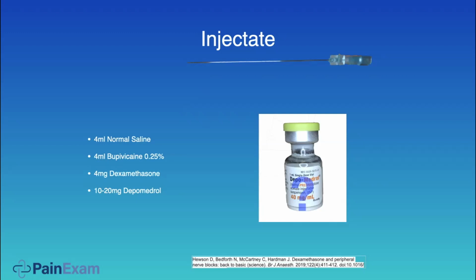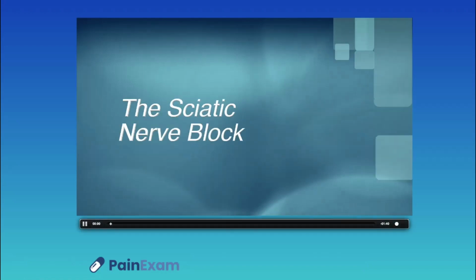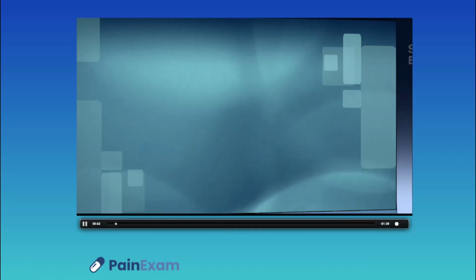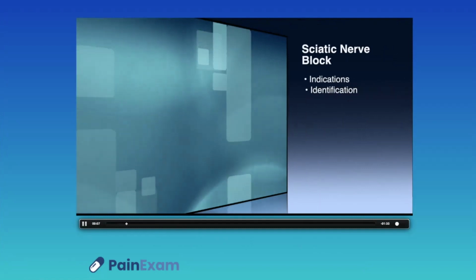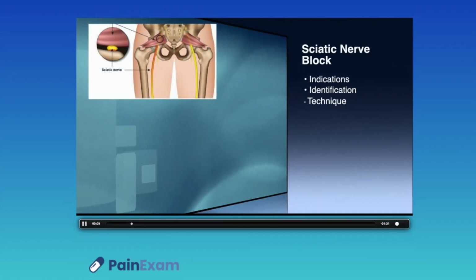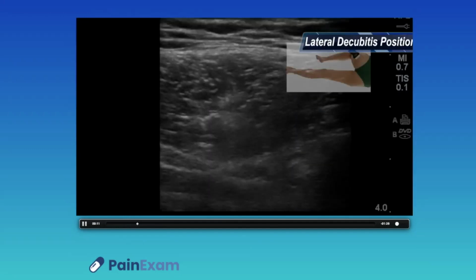However, if you're a beginner, once again, use a blunt needle, Stimiplex, one of these blunt needles, and it could be any brand. I'm just mentioning that because that's what I used when I was in training, but now I use a 25 gauge 3.5-inch needle. Okay, and you can use Kenalog. Everything I'm saying here, I have no financial relationship with depomedrol or the Stimiplex people. This is just what I use in my practice, not to promote them.